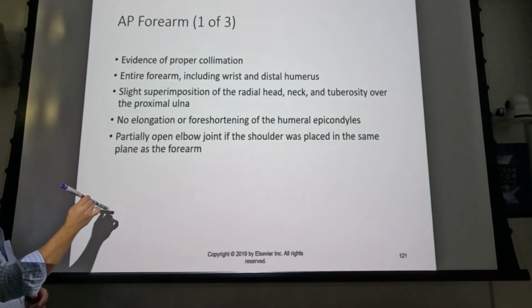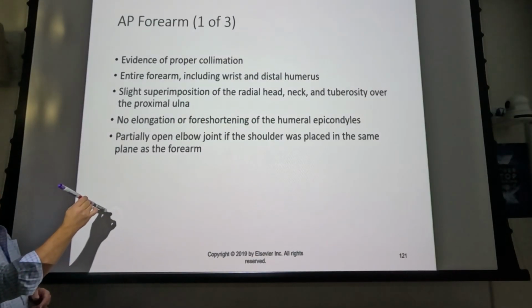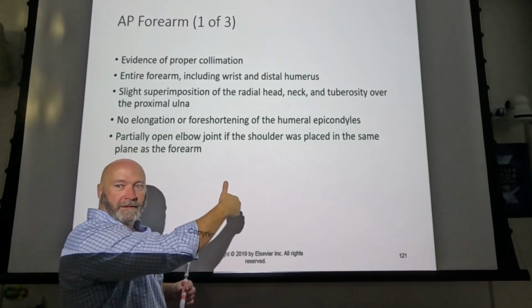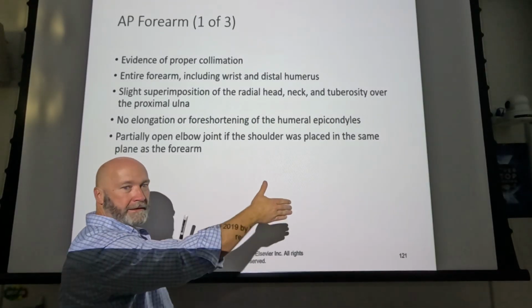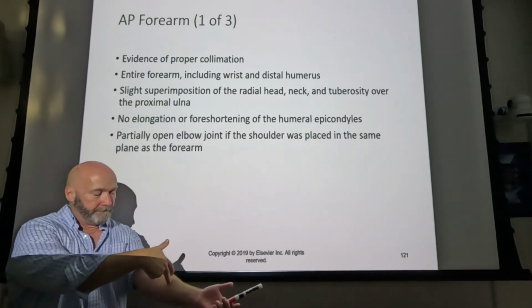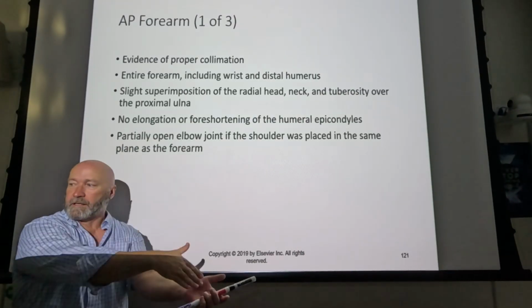Cylindrical, right. So it's impossible for me to move out this way without moving it some, but you get the point, right? Because the most perpendicular portion of the light field is right dead square in the middle of the screen. That means that everything away from the middle of this is at an angle. Okay, now apply that to the X-ray beam. The X-ray beam comes from a very small point, and if you put the middle of that right here, that's going to be the least distorted, and everything else is going to be at an angle.